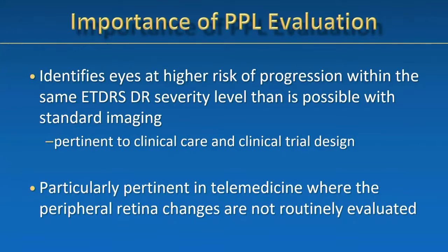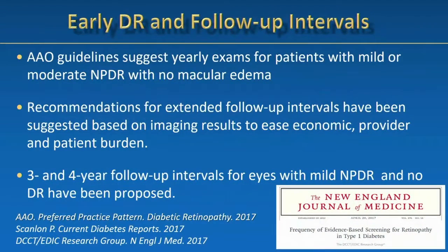But in the eye, PPL evaluation identifies eyes at higher risk of progression within the same ETDRS DR severity level than is possible with standard imaging. This is particularly pertinent in telemedicine, where the peripheral retinal changes are not routinely evaluated. It's also gaining importance because there are recommendations for extended follow-up intervals that have been suggested based on imaging results to ease economic, provider, and patient burdens.